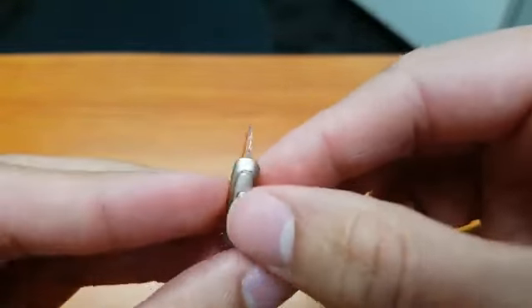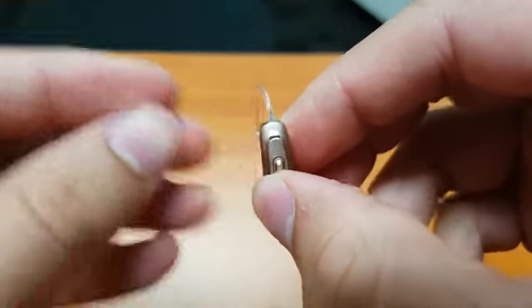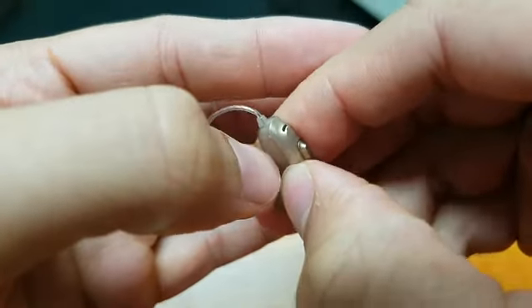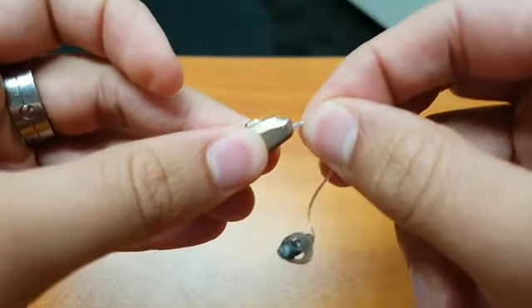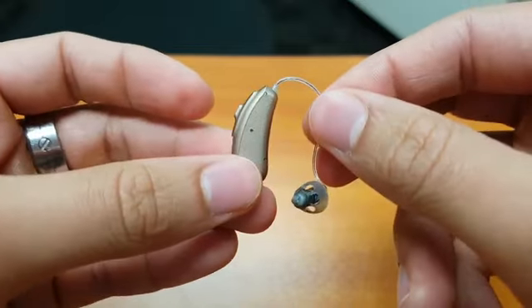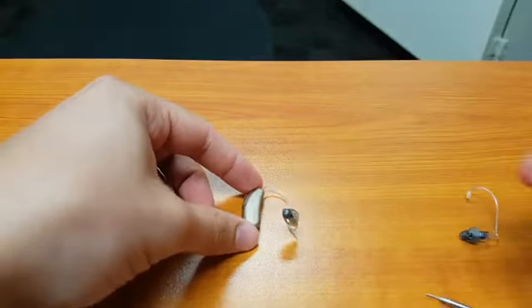And what we'll need to do is to lock the receiver back in. So essentially you just push on that grey portion and that's locked into place. Yep, and if we give that a bit of a pull, that receiver's not going anywhere, so it's nice and secure. And that's how you replace a receiver.